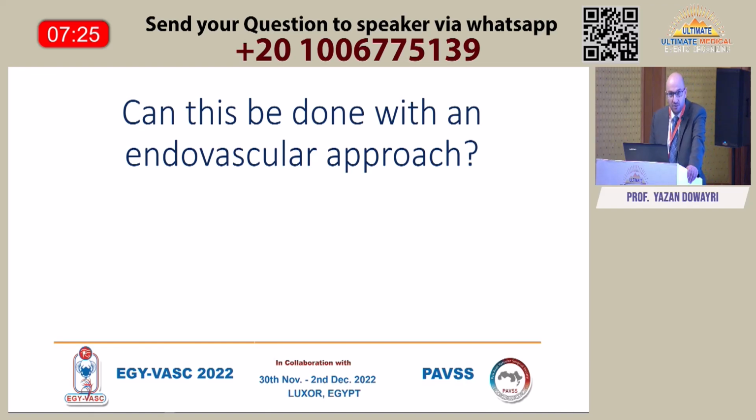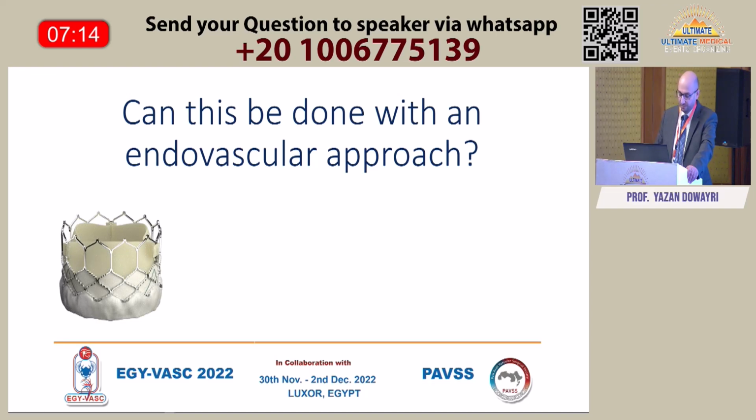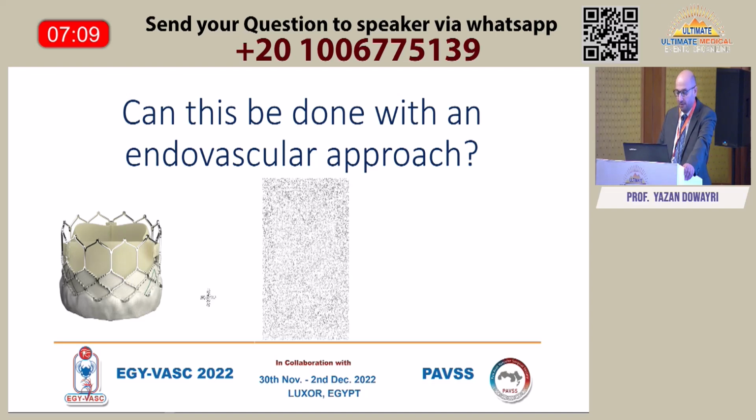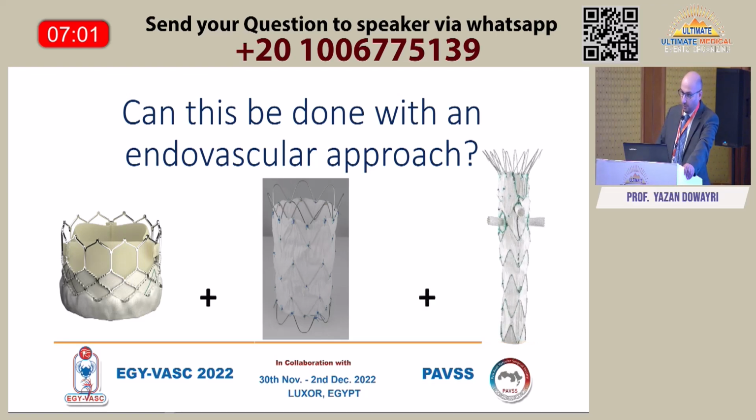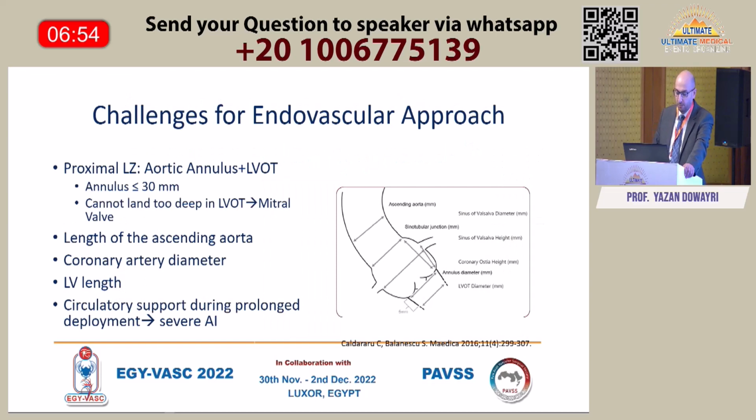Like everything else we've experienced in the last 20 years, the question always arises if there is a role for endovascular devices in treatment of the aortic root pathologies. We do have an endovascular treatment for aortic valve pathologies with TAVR. We have stent grafts for all aortic aneurysm and dissection pathologies. And we do have emerging technologies for branched and fenestrated devices. So the question is if we can deploy those techniques in treatment of the aortic root.